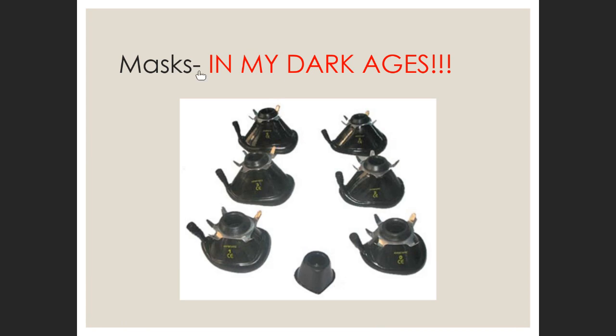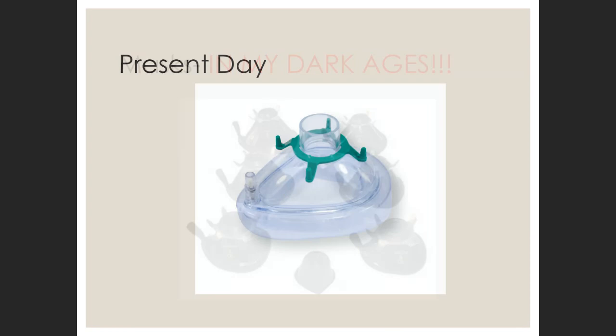So Dr. Minot has this thing from the dark ages, because we did make masks then of rubber. They were the same body, cuff, inflation. These are the prongs that can fit the harness on, and that's the connector. This is a special baby mask for probably a neonate. All right. Now they're transparent.